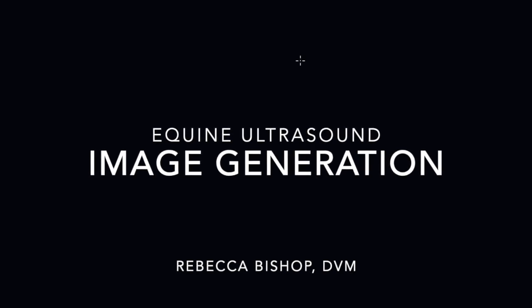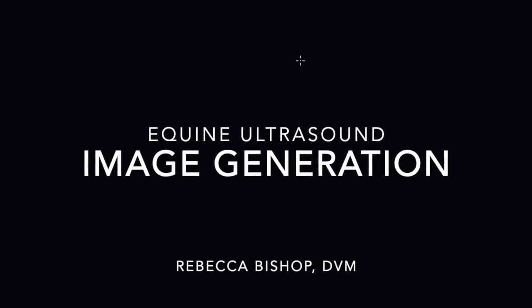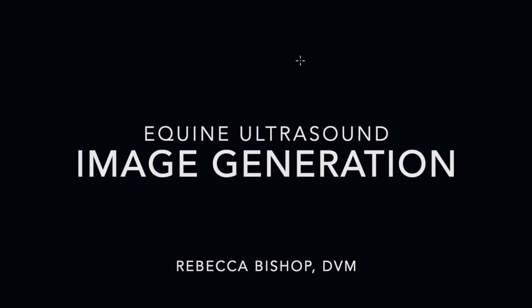In this video, we'll be reviewing the physics that your ultrasound machine uses to generate an image. The ultrasound machine generates an image using pulsed waves that are emitted by the ultrasound transducer. The frequency of the pulsed wave varies depending on the type of transducer, from 3 up to 20 megahertz.